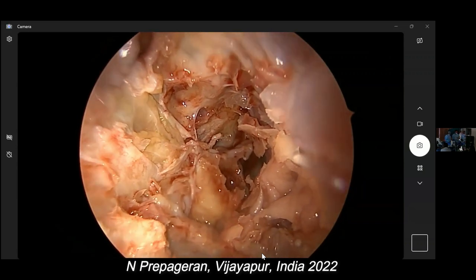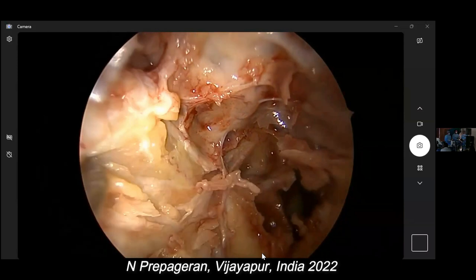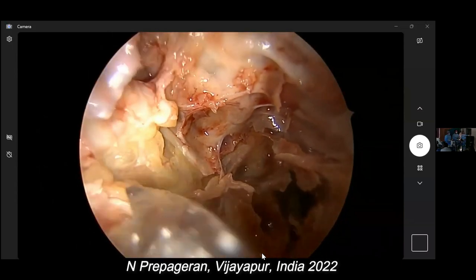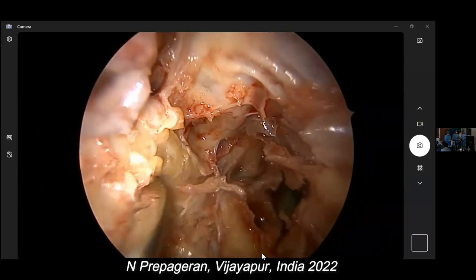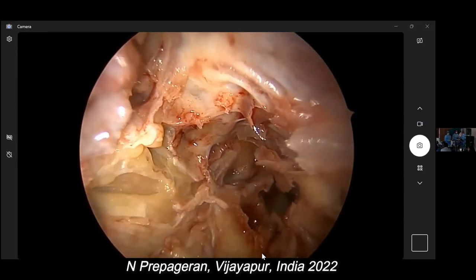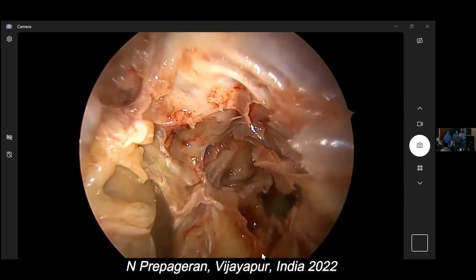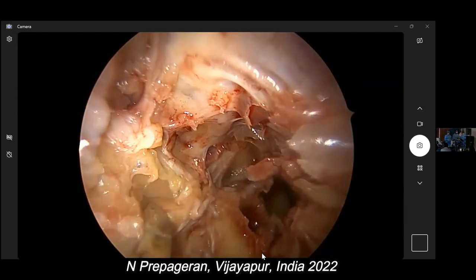I've got no problem. So now, I'm going to open the medial rectus muscle. So you will see the dissection I'm doing is exactly like the surgeries I showed you. That's the muscle. Can you guys see that? Yes, sir. You can see.